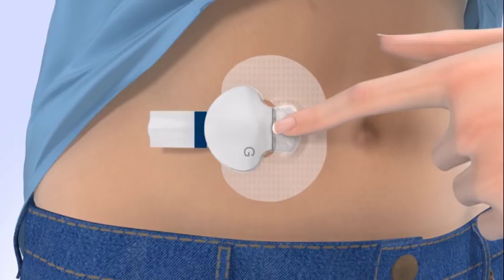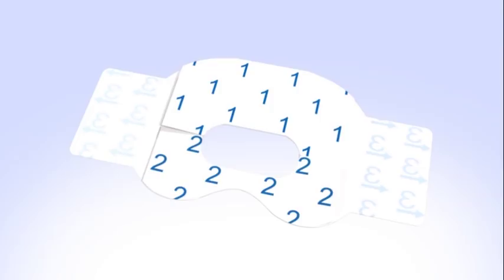Once the transmitter is connected, remove the adhesive liner from the adhesive tab, fold the adhesive tab over, and stick it on the transmitter. Be careful not to pull the adhesive tab too tightly. Now you need to apply a second piece of oval tape to the sensor and transmitter.